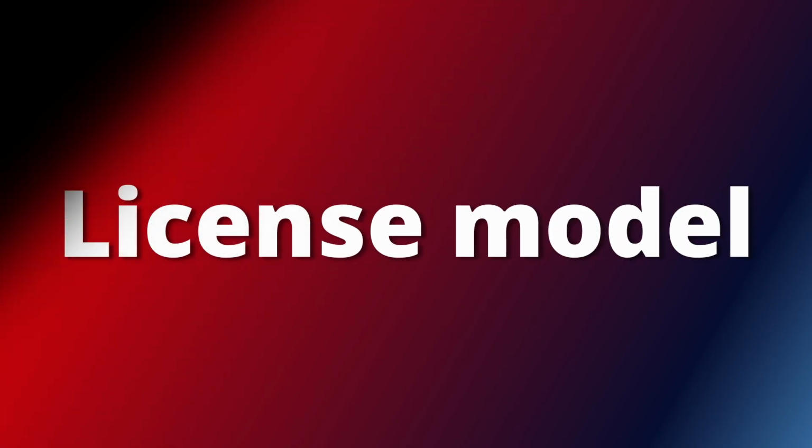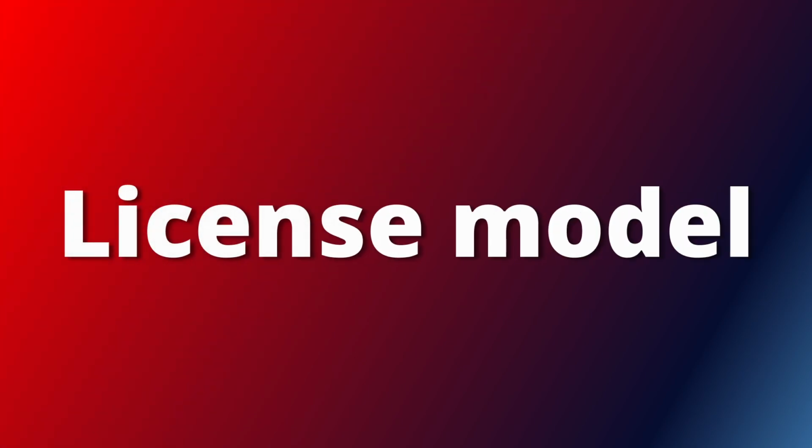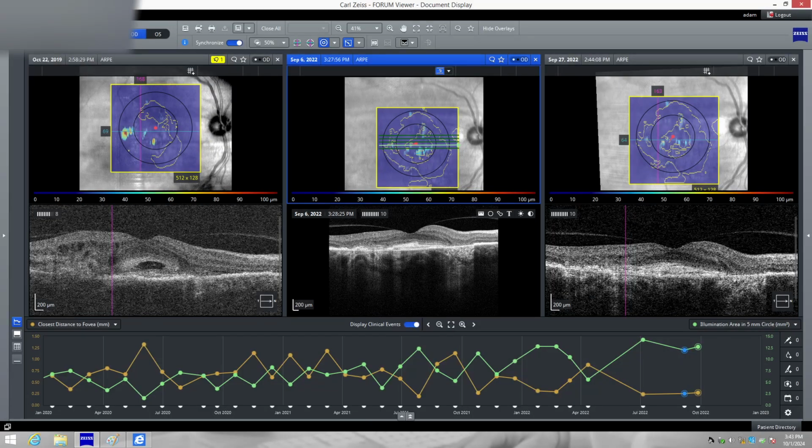It makes sense if you have a huge hospital and then you have people who are just doing retina, people who are just doing cataract. So for them, naturally, you just don't spend money on things that you don't need. That's the one thing. But on the other side, you need to really calculate it cleverly.